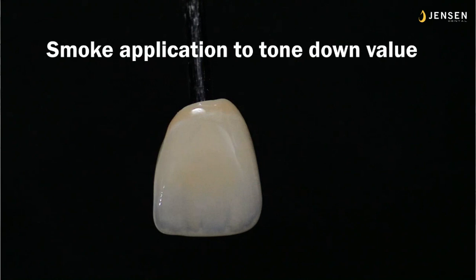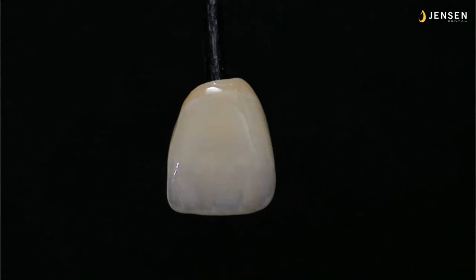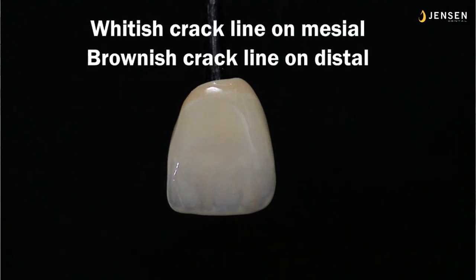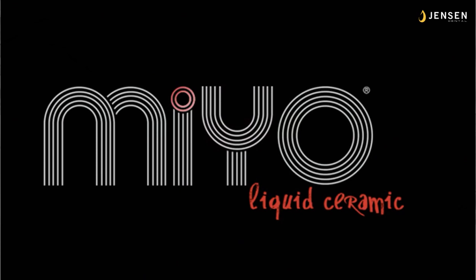And I used a little smoke in the incisal third just to make it a little more translucent, a little hypocalcification in the middle third right here, and a whitish crack line on the mesial and a brownish crack line on the distal. So there's the final restoration. Easy to get these effects. Takes you about 2.5 to 3.5 minutes total time, then to fire it.